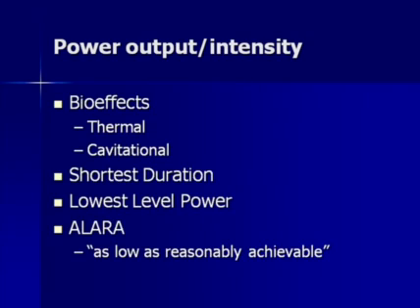And again, transcranial Doppler is one of those areas where we really have to pay attention to our power output and remember bioeffects that can and do occur with ultrasound, and we need to do this as quickly as possible, put our power levels as low as possible, and remember the rule of ALARA, as low as reasonably achievable.